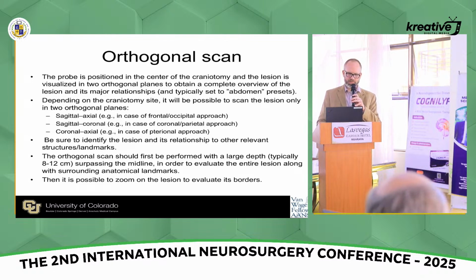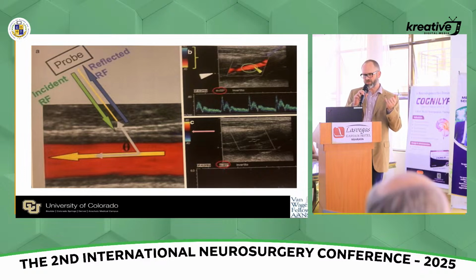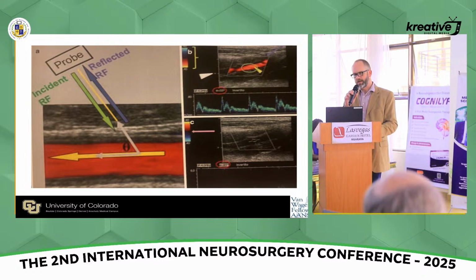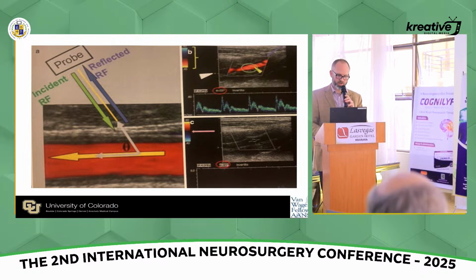Vascular imaging, we talked about the Doppler effect. The wave is proportional to the velocity of the blood. The direction of the vessel matters if you are trying to get continuous wave Doppler to get accurate velocity information. And on color Doppler, red typically is towards you, blue is away from you. It's not artery versus vein. To know that, you have to look at the waveform of the vessel to see if it's arterial or venous in terms of the waveform and the velocity.